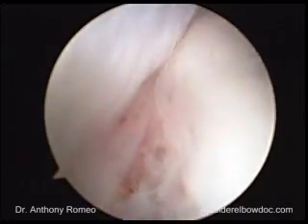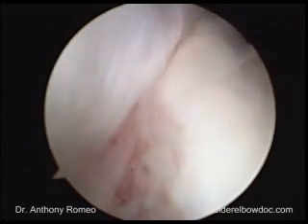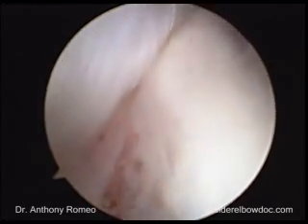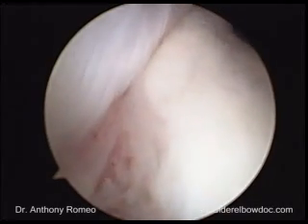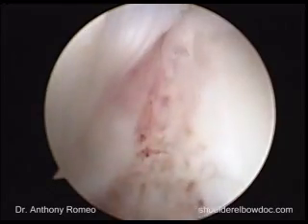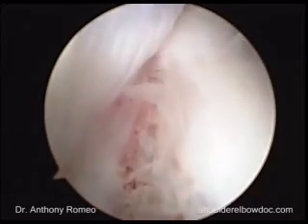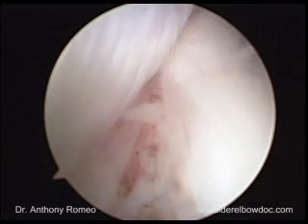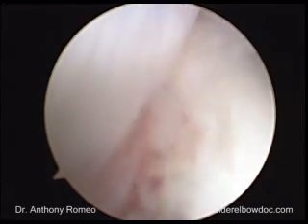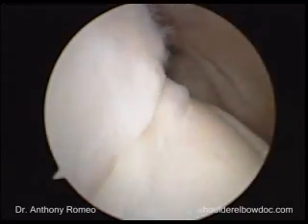The top of the bare area actually marks the leading edge, or the most superior edge, of the infraspinatus within 3 to 5 millimeters. So if you have a massive tear involving both the supraspinatus and the infraspinatus and you're not exactly sure where the infraspinatus should go, if you put the leading edge of the infraspinatus to the top of the bare area, you'll have an anatomic repair of your infraspinatus. That's an important landmark.